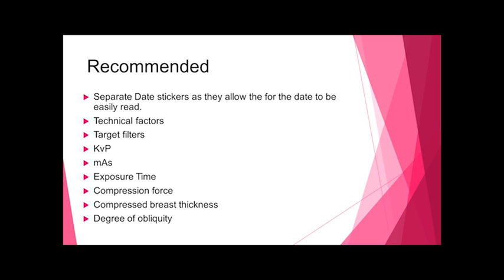Technical factors are recommended: target filter combination, kVp, mAs, amount of exposure time, compression force, compressed breast thickness, and degree of obliquity on the MLOs. And remember, the compressed breast thickness can read out in different measurements.